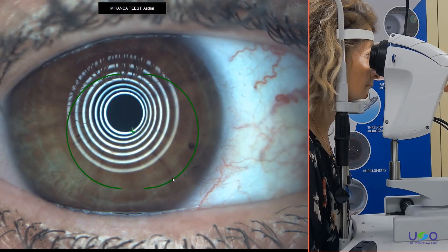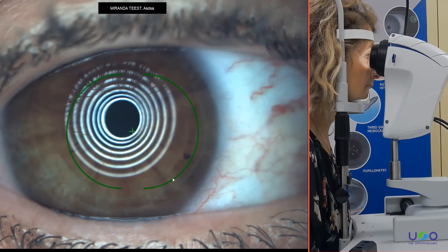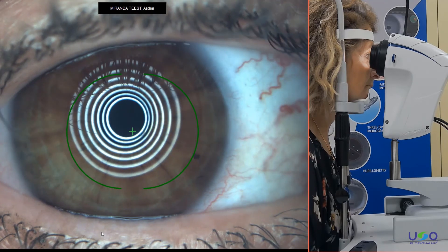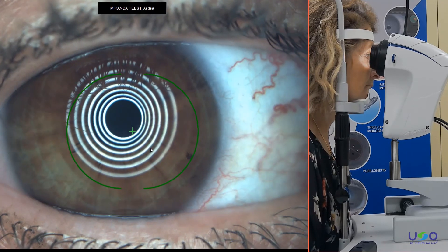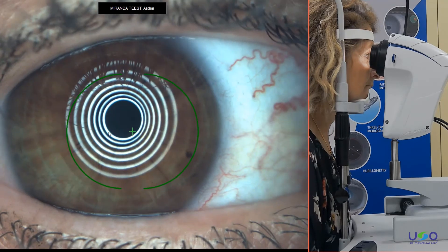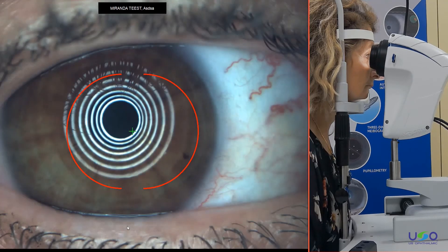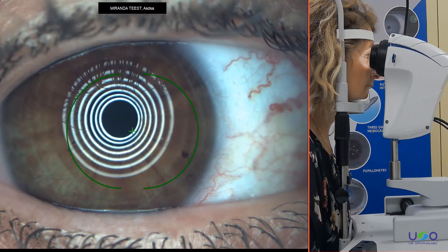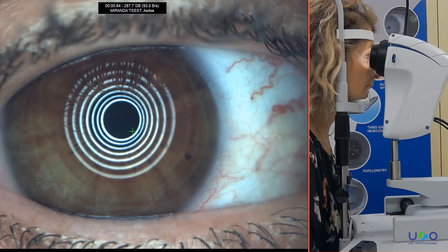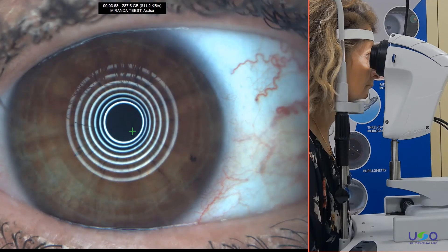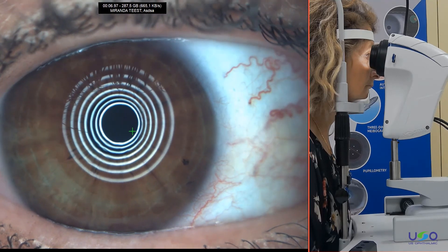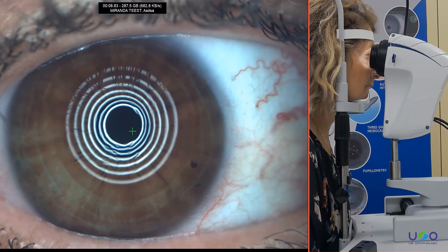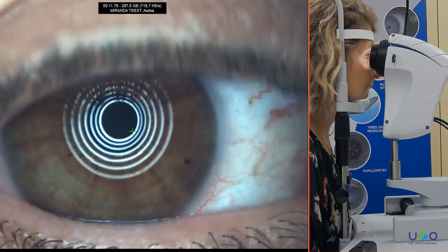The second fundamental suggestion I was giving you is to keep the tear meniscus in the screen. Because as we said before, later on we can take a frame from the video and we will analyze the tear meniscus. So once the picture is on focus, I start the video and I ask the patient to blink twice and keep open the eye until she can. Again, we don't want to force the patient. Okay, I think now it's more than enough, she was blinking.